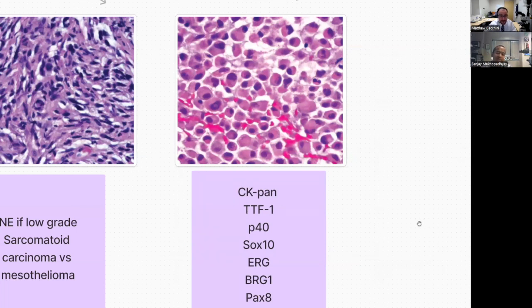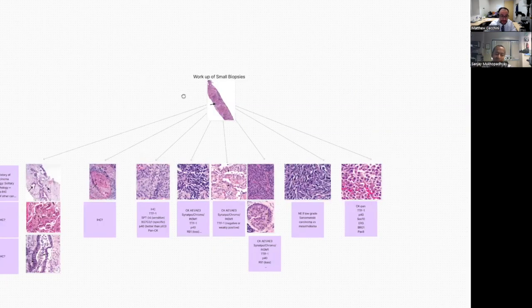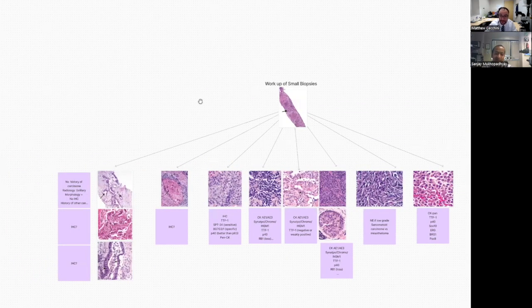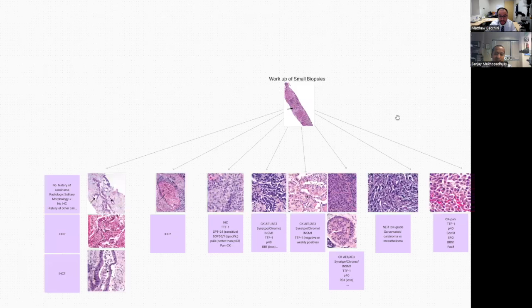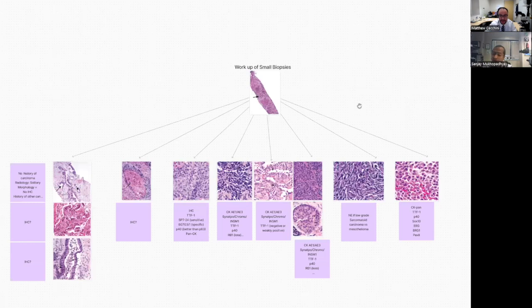That's great. Well, I think this was a good discussion of different approaches to IHC and small biopsies. Any last points you wanted to give to our listeners, Sanjay, before we close? No, this is terrific, Matt. Thank you so much for having the idea to do this. It's such a great idea. I'm trying to think of what else comes up in biopsies where immunohistochemistry is needed, but I think you've covered everything.